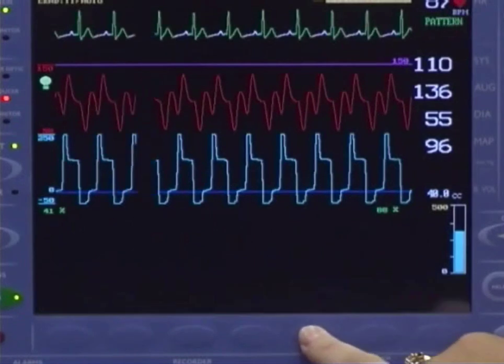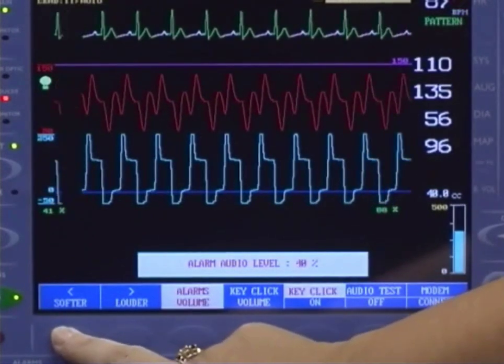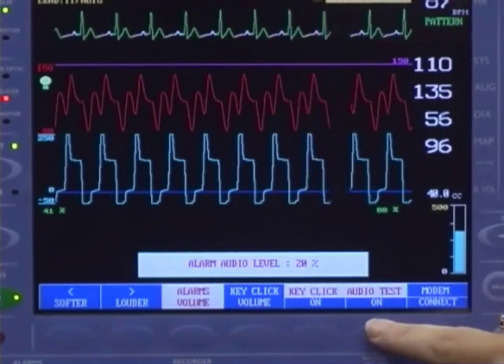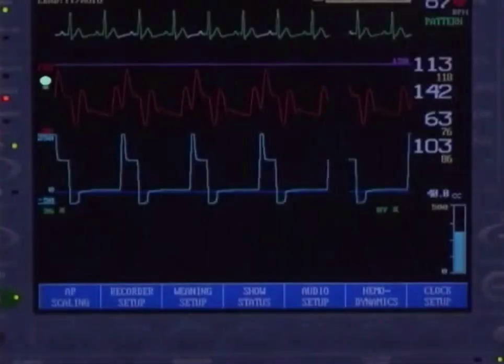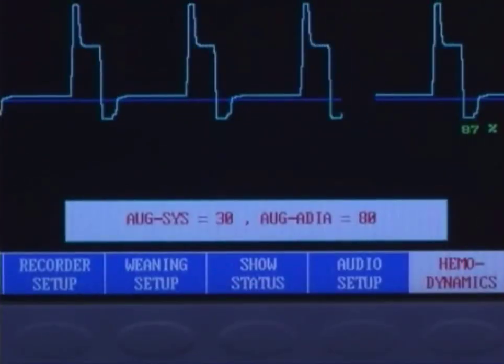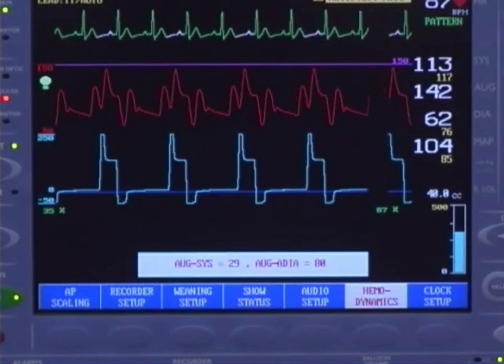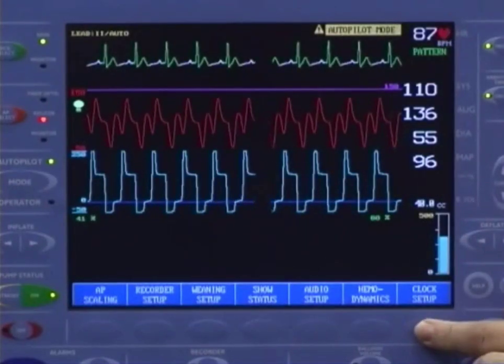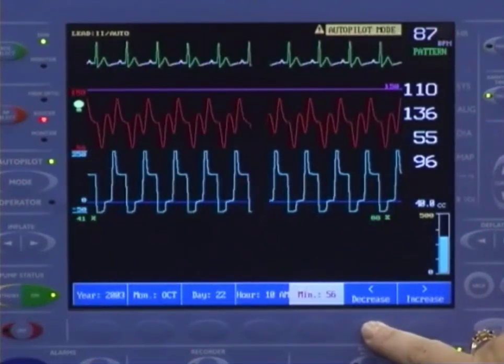Audio Setup allows changing the alarm volume. Select Alarm Volume and use the louder or softer keys to adjust the sound. The volume can be adjusted between 10 and 100%. You may test the level by pressing the Audio Test key. You can also adjust the volume on the key clicks or turn the key clicks off. Pressing the Hemodynamics key will cause the pump to calculate the difference between the augmented pressure and the systolic pressure, and the difference between the augmented pressure and the diastolic pressure for the full pulse pressure. In addition, the hemodynamic numbers will freeze for 30 seconds. The final function to be found under the Home key is Clock Setup — choose the desired parameter to change and then use the up and down arrow keys to correct the time or date.